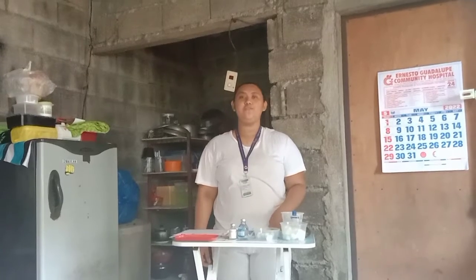I am Tisha Nuevo from BSN11G, and in today's video I am going to perform parenteral drug administration, such as the intradermal, subcutaneous, and intramuscular injections. This demonstration is of a medication that enters the body by injection through the tissue into the circulatory system. First, parenteral medication: intradermal.